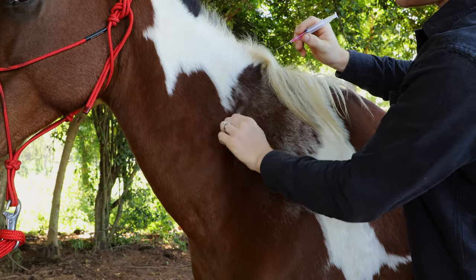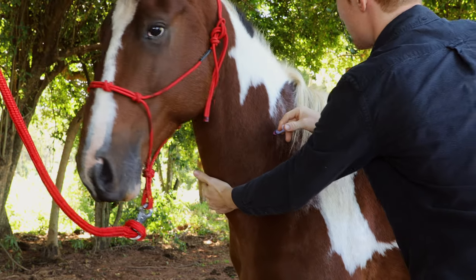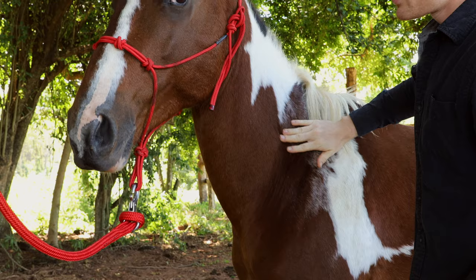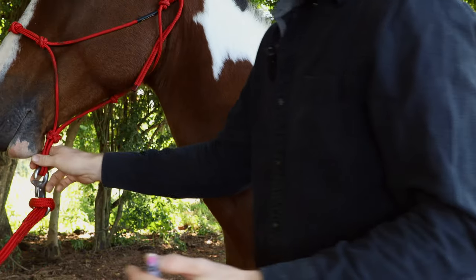So what I'm going to do is just nip up the skin here, tap, tap, tap, put the injection in, and then go ahead and syringe it in, pull it out, and then we're good to go. You can see there he had a pretty interesting reaction, but that was pretty good honestly for his first time ever.